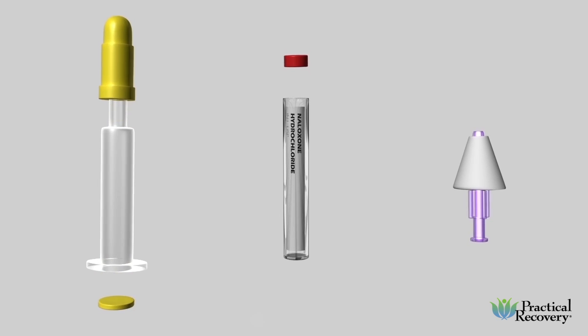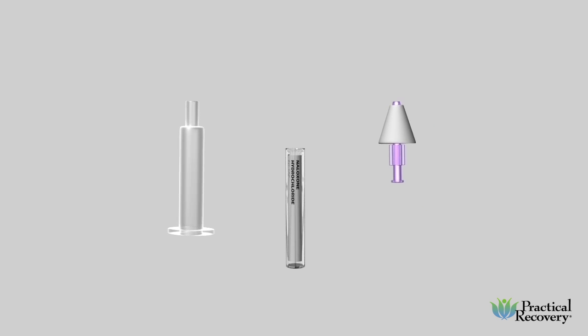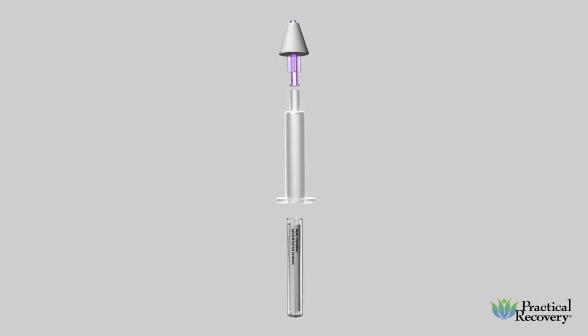To assemble, remove yellow ends from the applicator, remove the cap from the vial, and gently insert the open end of the vial into the open end of the applicator and twist until you feel a slight resistance. Attach the atomizer to the assembled vial and applicator unit.